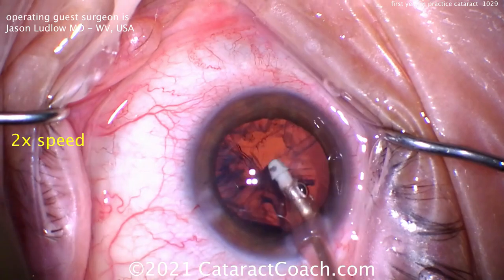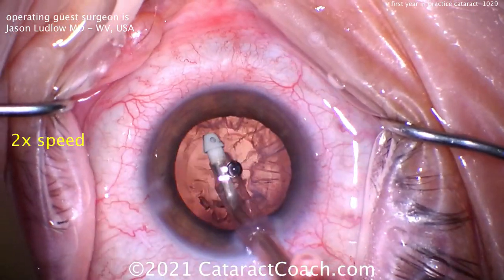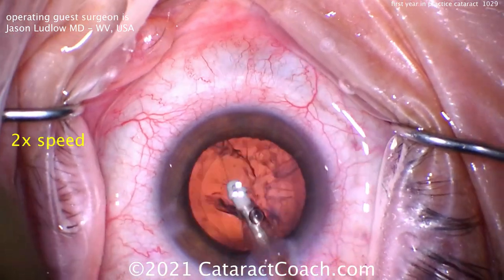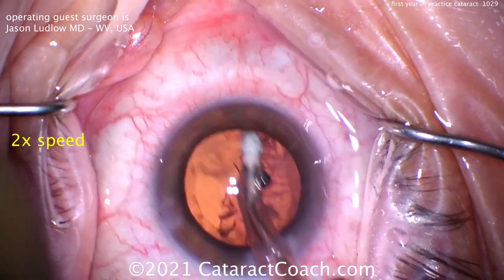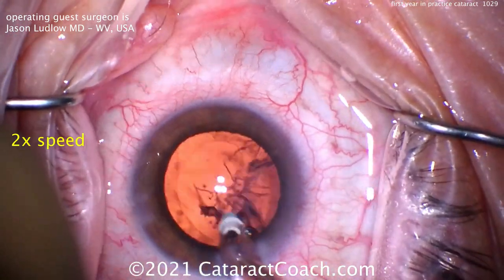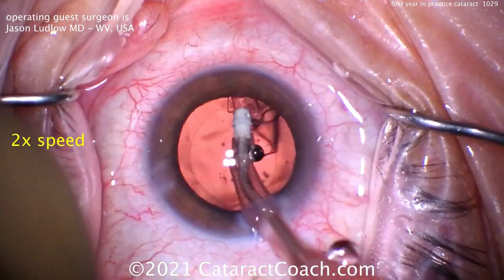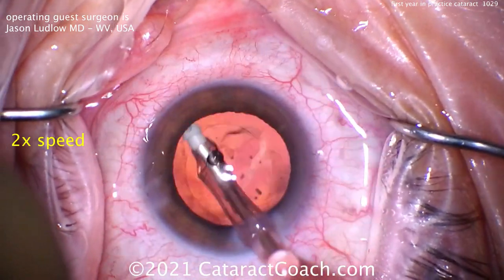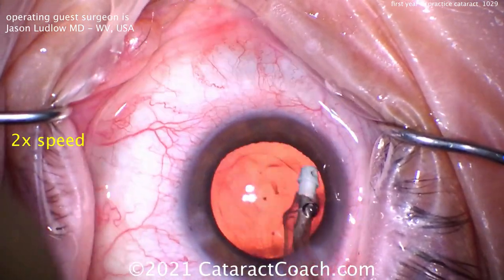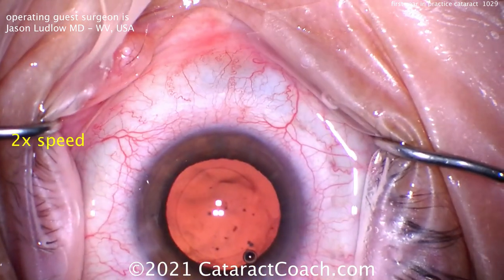Now time for cortex removal. Coaxial cortex removal — I frequently do that technique as well. Nice technique, going circumferential to grab sufficient degrees of cortex prior to stripping it centrally. And again to the other side. That looks great. Cleaning this up. The sub-incisional area is one time where the eye may go slightly out of primary. Polishing up the capsular bag. That looks really beautiful, very nice result here.